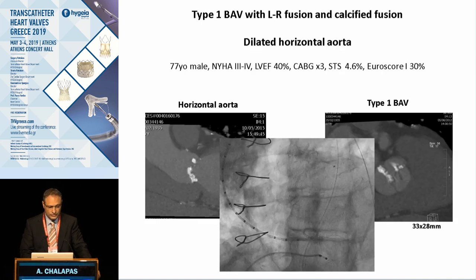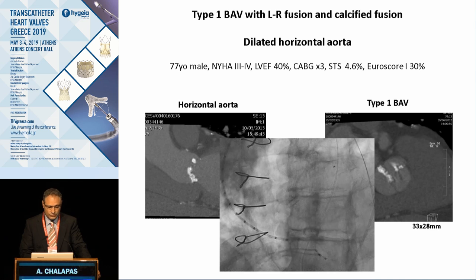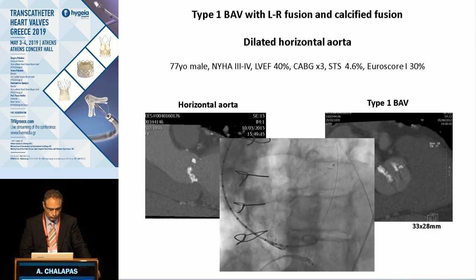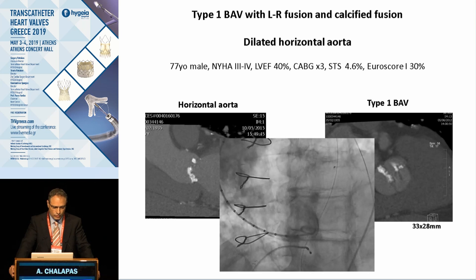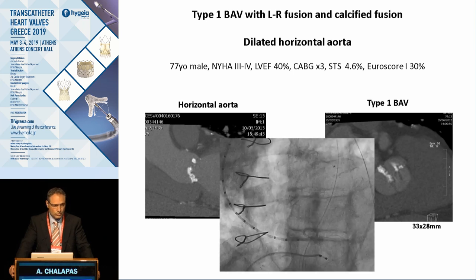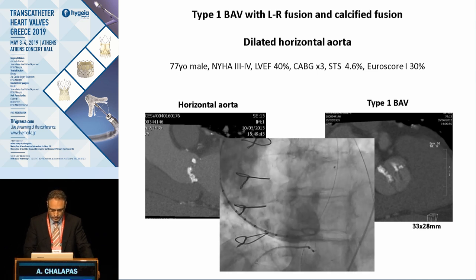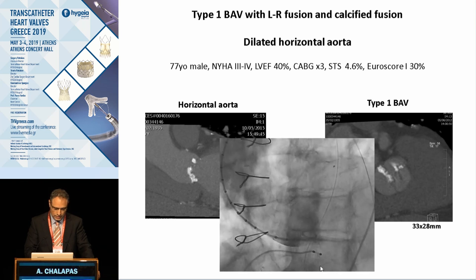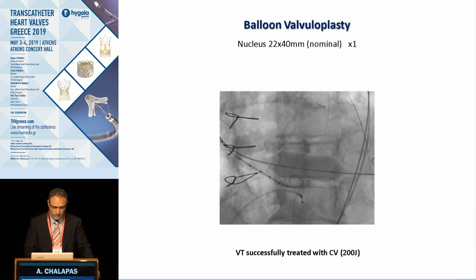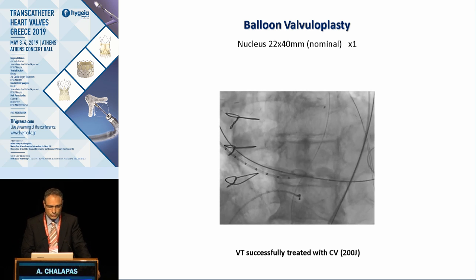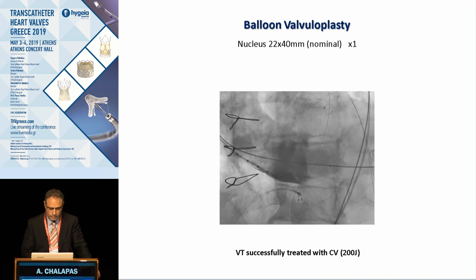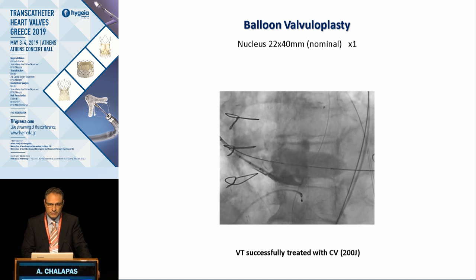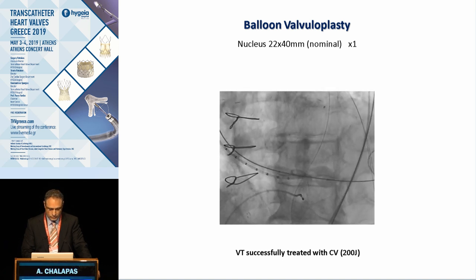Here is an interesting example of a type 1 valve with left-right fusion and calcification. From the CT, there is a horizontal aorta, a large calcium volume not only at the level of the annulus but also calcium protruded into the LVOT. From the aortography, we see the horizontal aorta and the dilated aorta. We started with valvuloplasty using a 22 mm balloon, with incomplete sealing, some paravalvular leak, and the patient experienced VT, which was successfully treated with cardioversion.